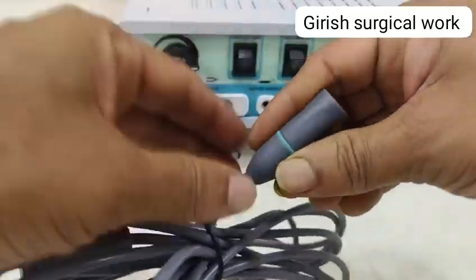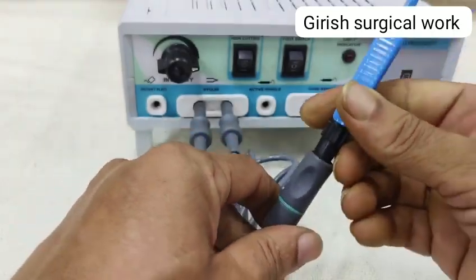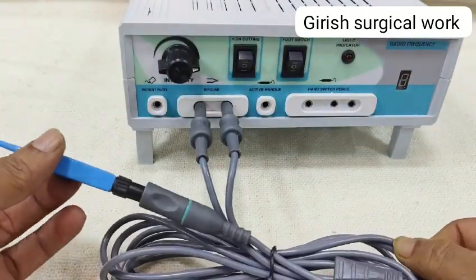At the other end, in this connector, you have to insert the bipolar forceps. So this is how the bipolar cable is being used.